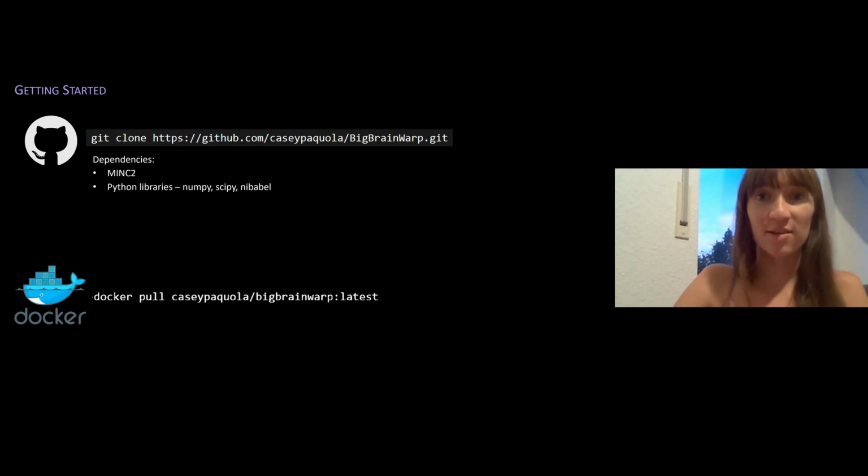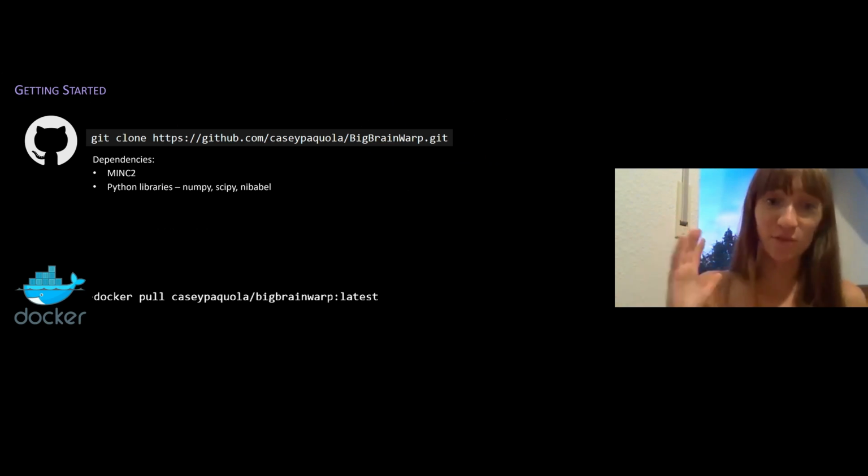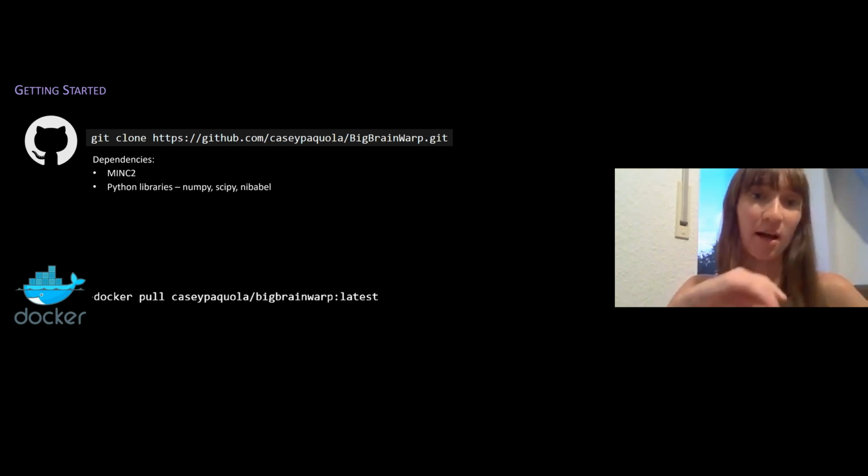And I can just give a little bit of background on how to get started and just to run a couple of scripts, but it's a pretty simple toolbox. This won't take so long. And yeah, feel free to just jump in and ask questions at any time, but otherwise I can just take a few minutes to give a brief overview of how to install and things like that.